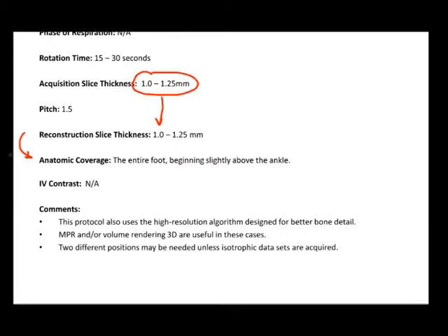IV contrast is going to be none. And the thing that we need to keep in mind is that this protocol also uses the same high-resolution algorithm designed for better bone detail. So we're utilizing smaller, lower slice thicknesses.